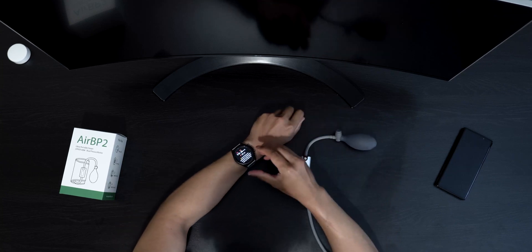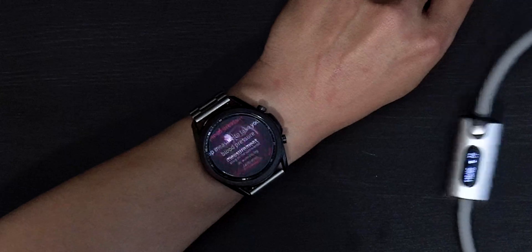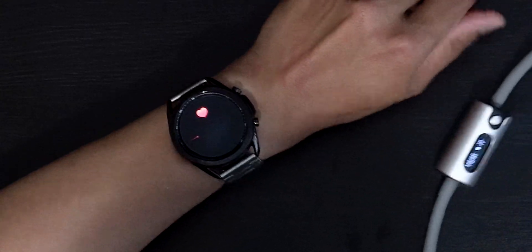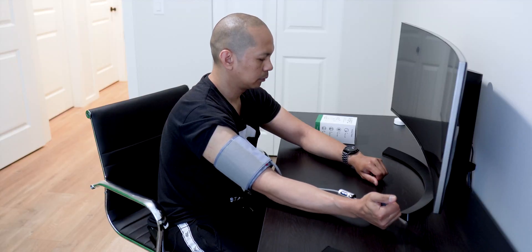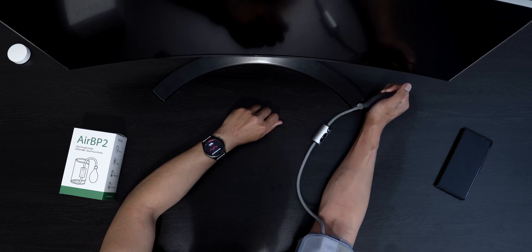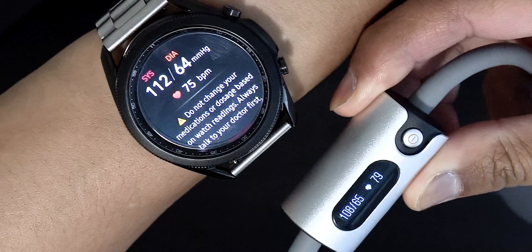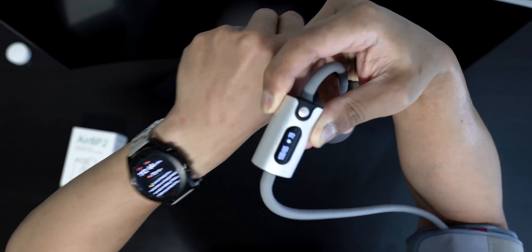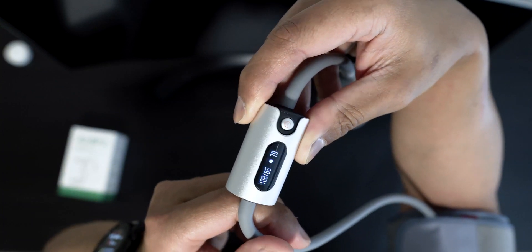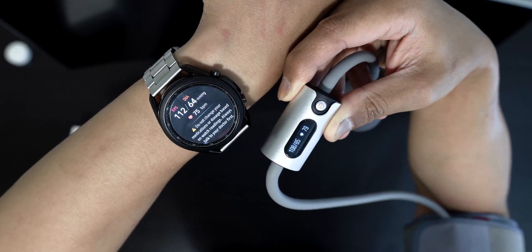Alright, let's do another one. Here is the second test. The Watch 3 gave 112 over 64 with a heart rate of 75, and the machine gave 108 over 65 with a heart rate of 79. This one is slightly off.